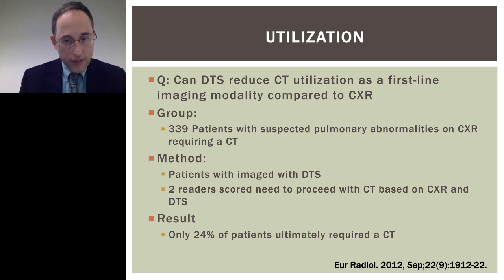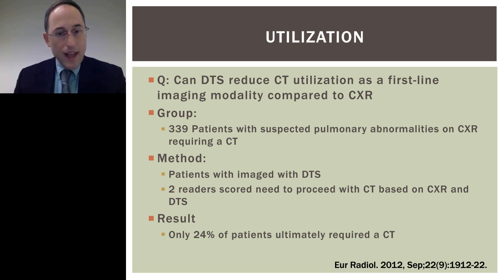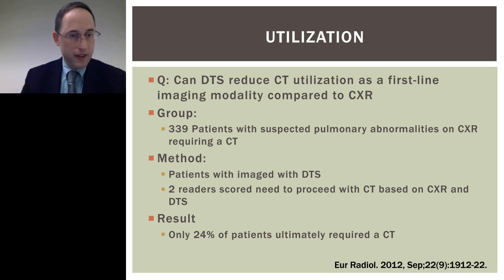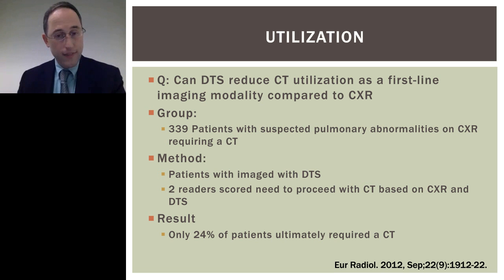They had people look at the study and then decide, do we really think this patient needs to go to a CT now that we've seen the tomo? And the answer was that in only 24% of patients did they still want to send them to CT. In other words, tomo answered the question in 76% of the patients. Either it was nothing, or it was actually something, and tomo was sufficient, and they could stop there.